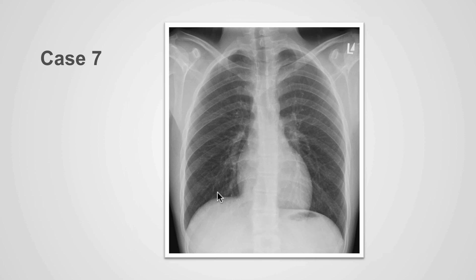Can you identify the pneumothorax in this case? Please pause the video and take a look. In this case, we can identify an edge that should not be present — this is the edge of the lung and the visceral pleura, with a small left-sided apical pneumothorax.